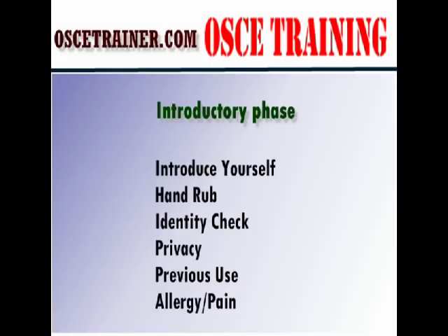In the introductory phase, check for scene safety, and approach the patient only after ensuring that the scene is safe to approach. You have to introduce yourself as a nurse taking care of the patient after doing a hand rub using the 7 steps of hand hygiene. There is no need to verbalize these 7 steps as it is clearly mentioned in the OSCE marking criteria. Confirm the patient ID using 3 checks: full name, date of birth, hospital number. Provide privacy to the patient.